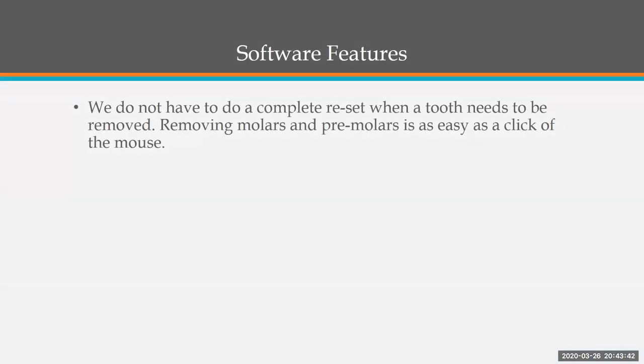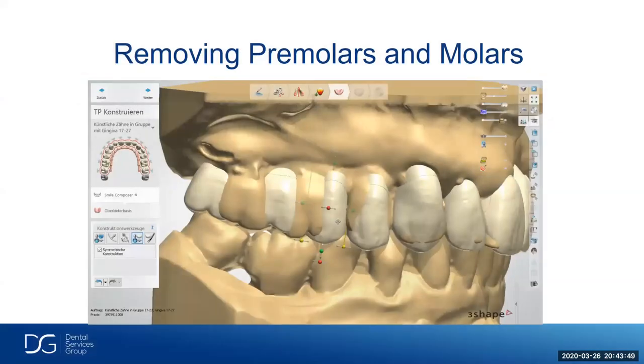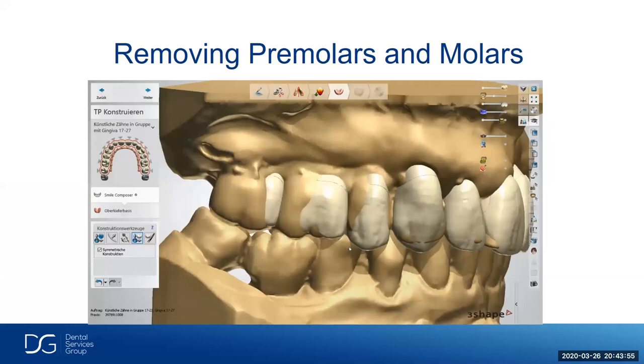And we don't have to do a complete reset when a tooth needs to be removed. Removing molars and premolars is as easy as a click of a mouse. In this particular slide, we're going to show the removal of a premolar in just one click. There you go. That was an easy setup. So real nice features with this, planning these dentures.